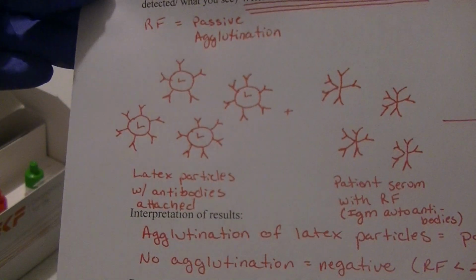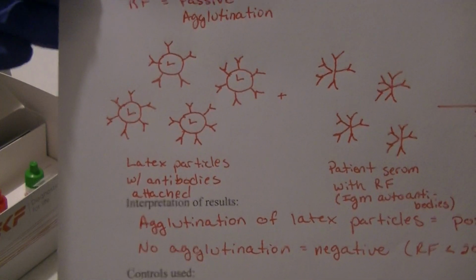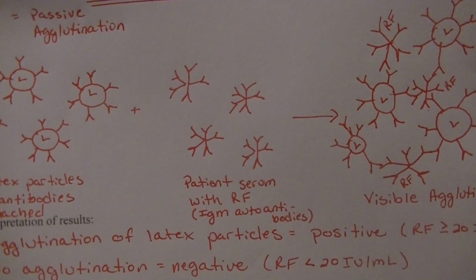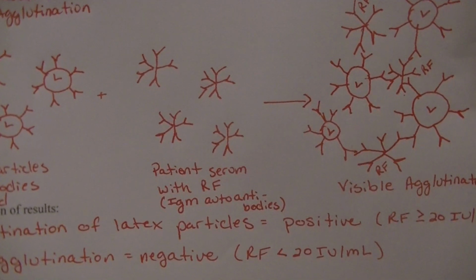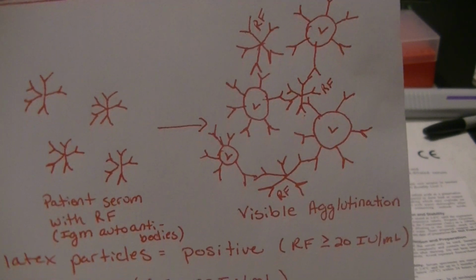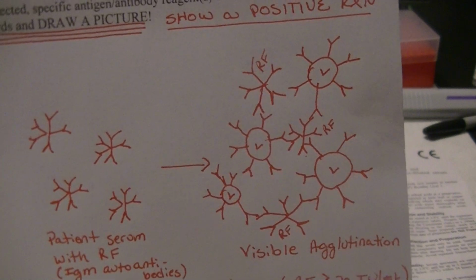So for this test, and this is written out for you in the principle in the package insert, latex particles have antibodies to rheumatoid factor attached to them. This is a passive agglutination test. Then, if we add patient serum that contains rheumatoid factor, which is an IgM autoantibody, we will get visible agglutination because the antibodies attached to the latex particles will attach to the rheumatoid factor and lead to cross-linking of those particles, and that's why we saw the white clumps in the positive reactions.